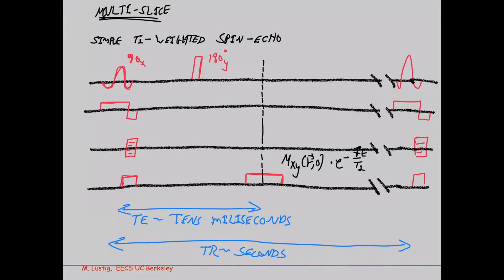So in the next slide, I'm going to take this part and make this selective, and I'm going to take this and do what computer science people do all the time, which is package this and do abstraction. Say, oh, this is a function that does this, and I'm going to have many of these boxes within a single TR. Okay, so that's kind of what I'm going to do.